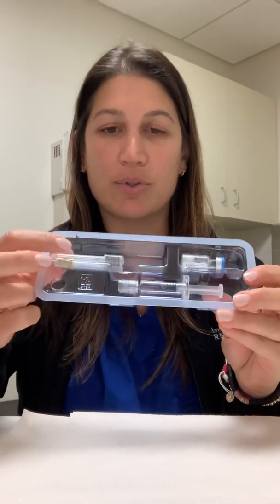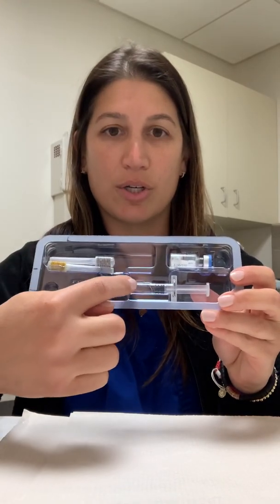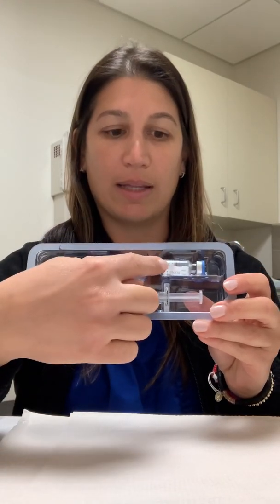Every time you go to use it and you peel that part off, you will see that it comes with two needles, a syringe already filled with water, and a vial with powder in it. So when you go to do this, first I'm going to show you the two things that can go wrong.